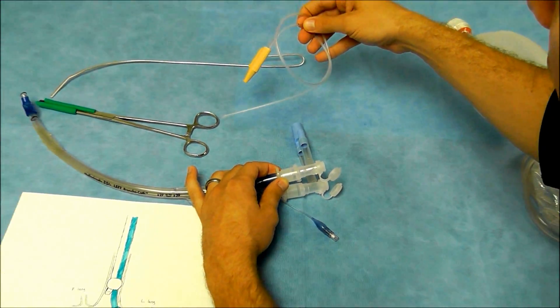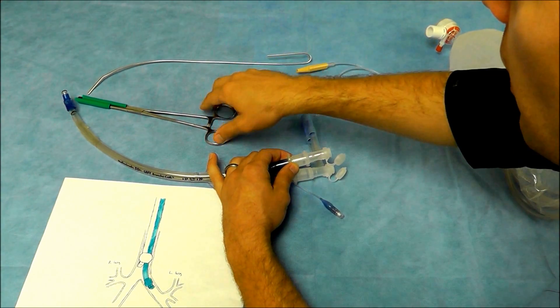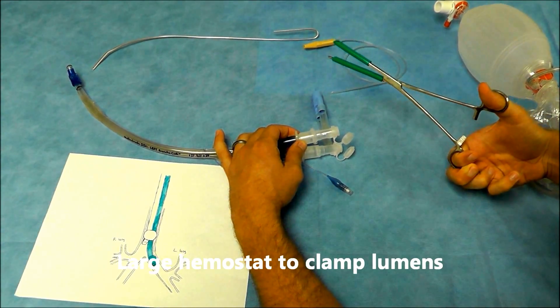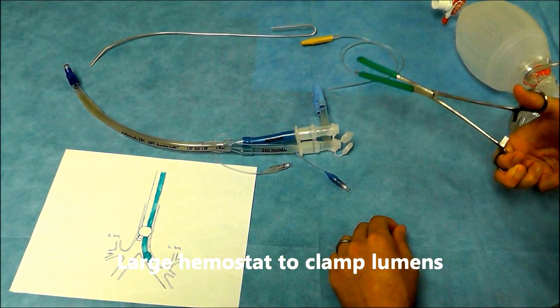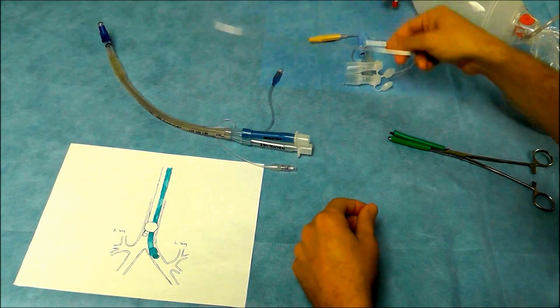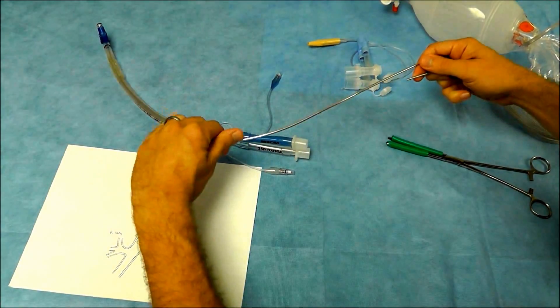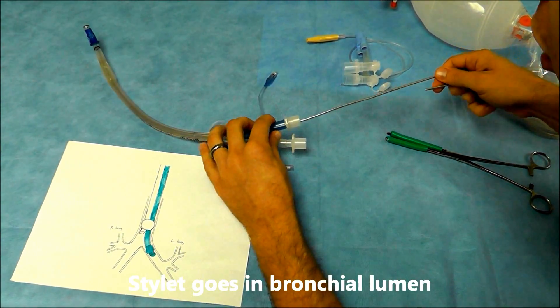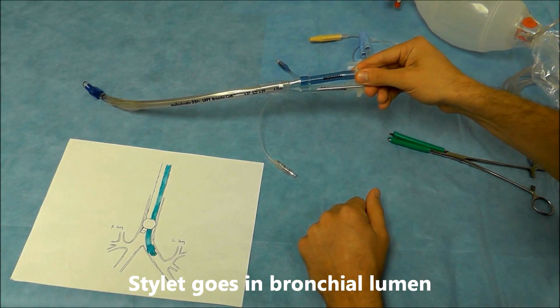You'll also need a suction catheter, a large hemostat to be able to isolate a lung, and a stylet to help you place the tube. Just know that the stylet always goes through the bronchial lumen.